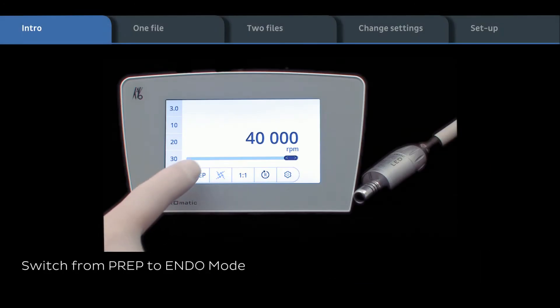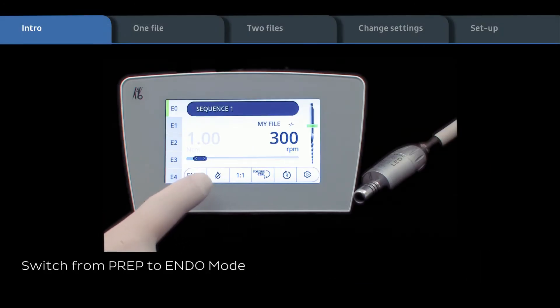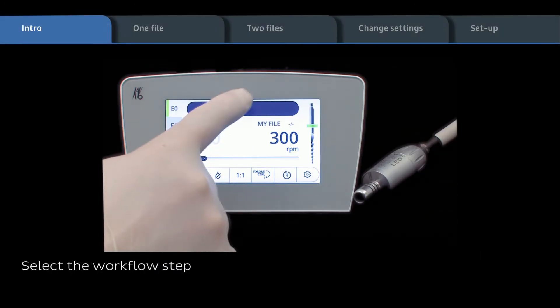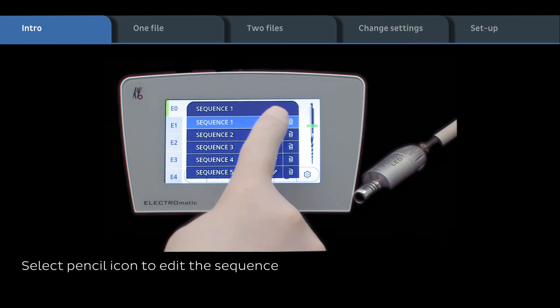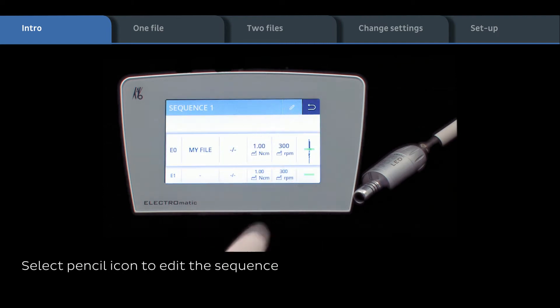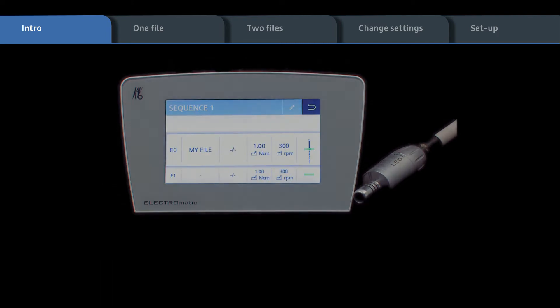Start by switching from prep to endo mode. Select the requested workflow step, then select the pencil icon to edit the sequence.